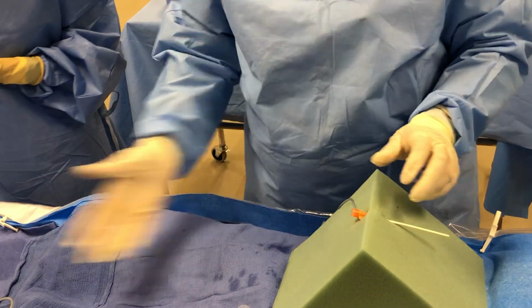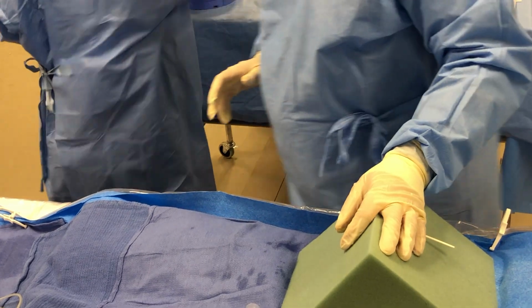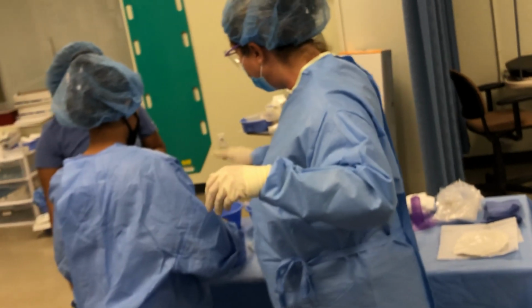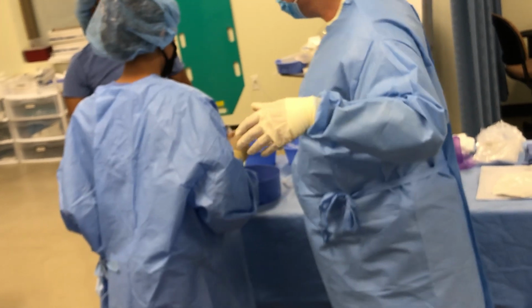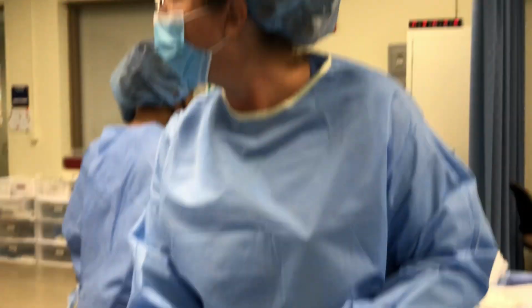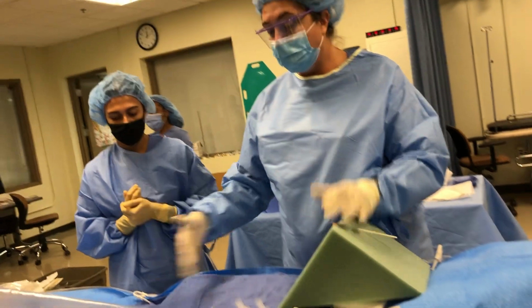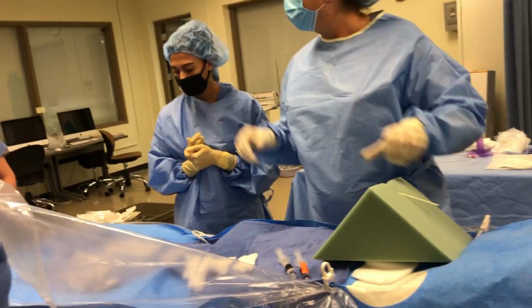Okay, then the doctor's just gonna throw that syringe down there. You're gonna squirt that into the waste, get a little bit of flush, just pull back, squirt that into the waste, you're cleaning that syringe. Now get him 6 more cc's of flush and bring that flush syringe back over here for him. Okay? Then we would be loading the catheter. Couple different ways, but we'll get into that next week.